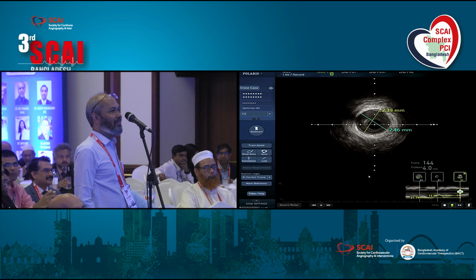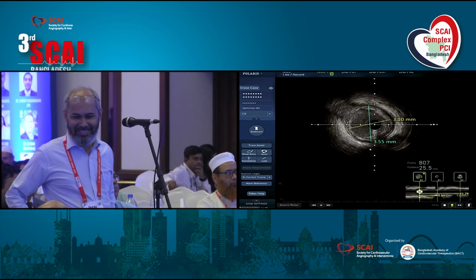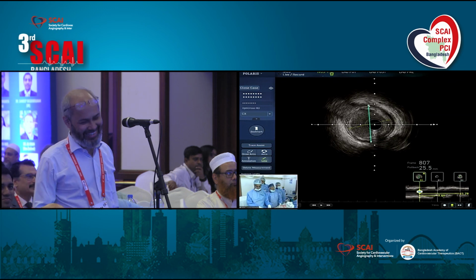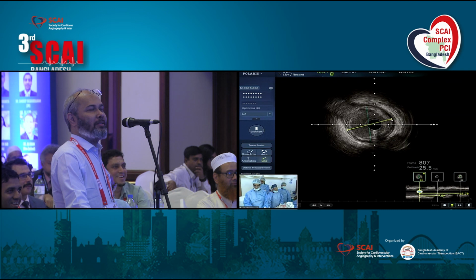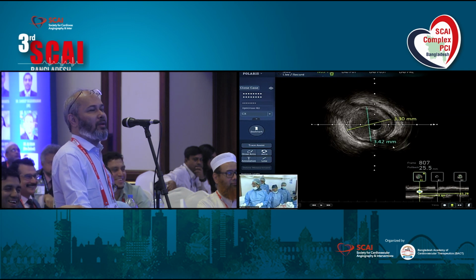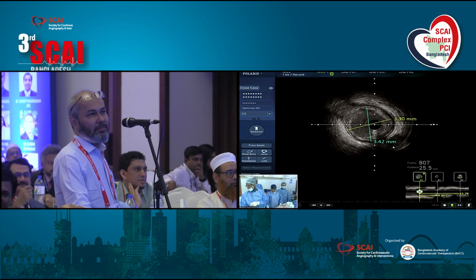But it is a plain balloon. As we know, the restenosis rate of plain balloon angioplasty is approximately 50%. Why should we keep it this way with a plain balloon in a case of a left dominant vessel with a PDA lesion having a small dissection?